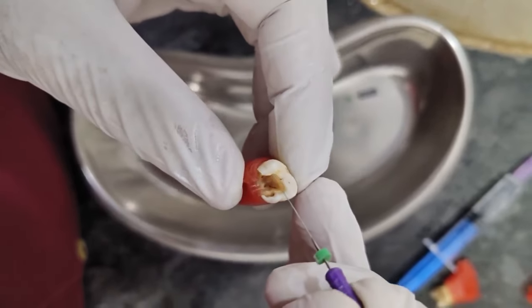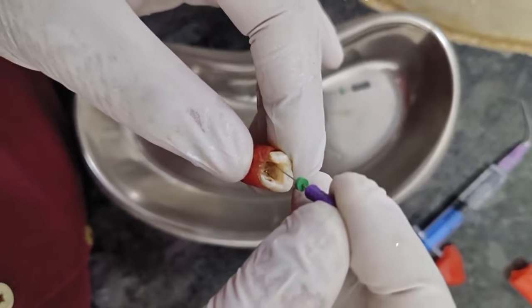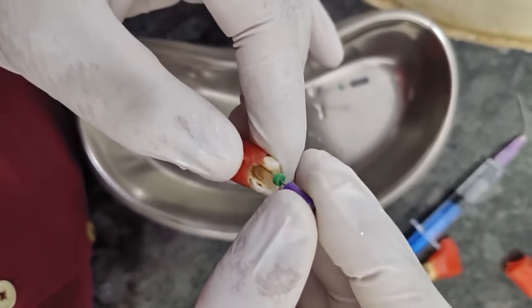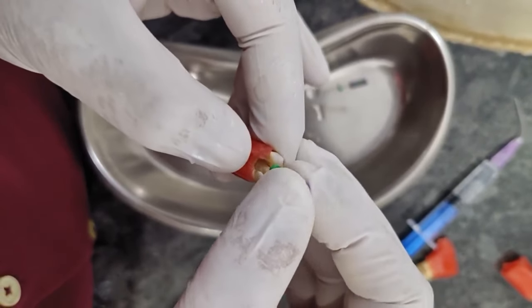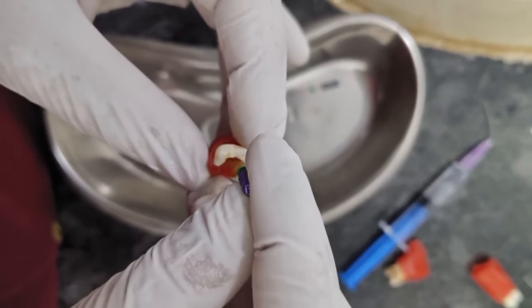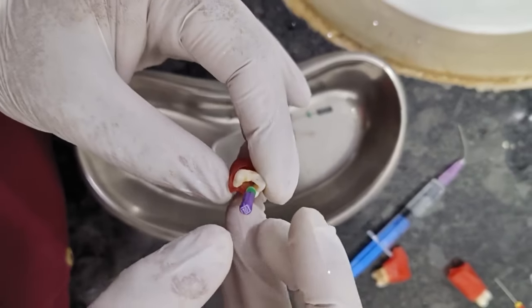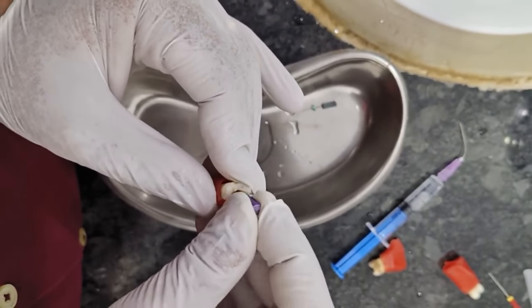So now we can see a little bit of visibility we have achieved. Now, after taking the x-ray, we can use the number 10 file and clean the canal in filing motion. We just have to adapt it to the walls and pull. Adapt it to the wall and pull motion. Similarly, this is the mesobuccal canal, as you can see, a little bit of filing.